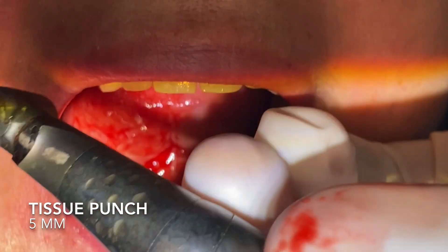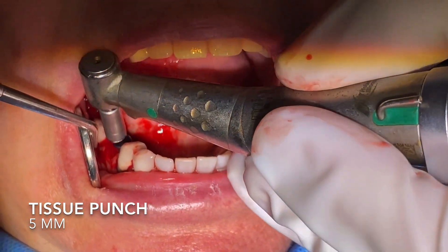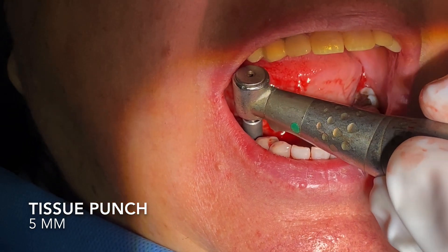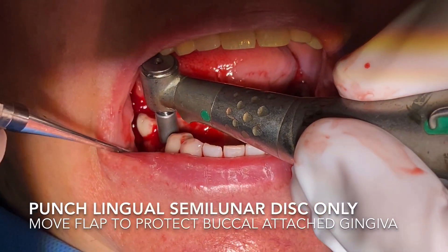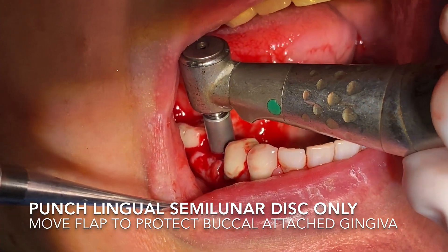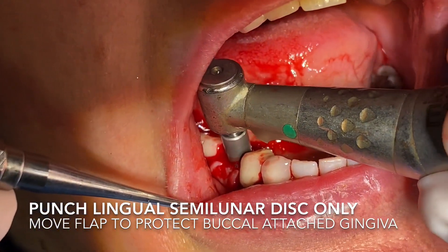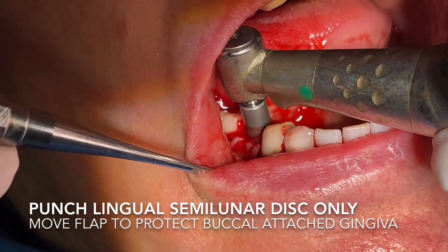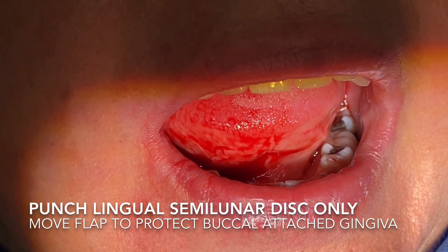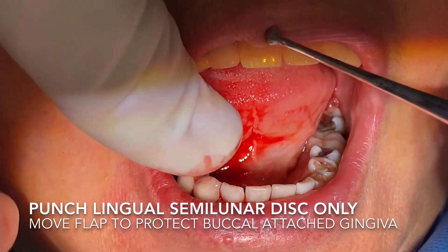We'll lift the buccal tissue out of the way so that we can come in with the disc cutter. This will punch the tissue and cut just the lingual aspect — we're doing a hemi disc flap. We're going to just punch that lingual and hold the buccal out of the way to get that little piece of tissue out of the area. We go at a very slow revolution, and we have to wiggle it a little bit because it is kind of an ovoid-shaped ridge. Then we can come back in and remove that piece of tissue.